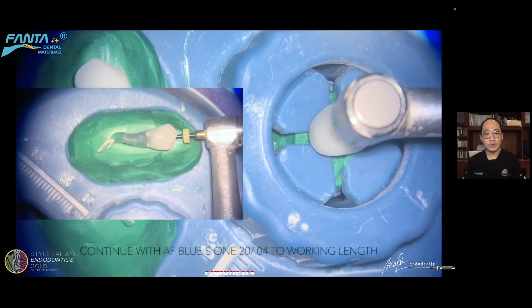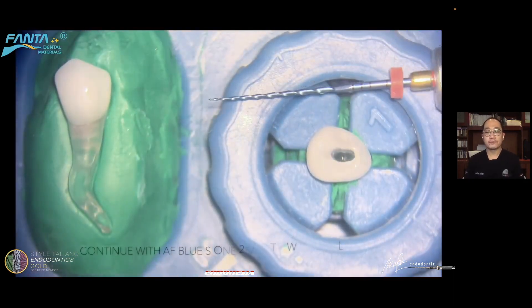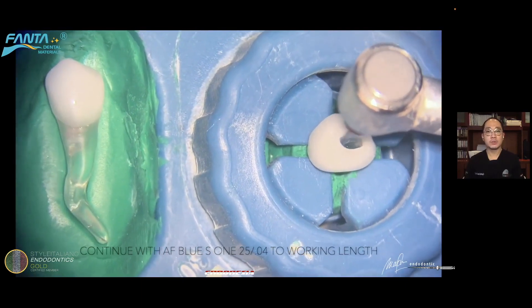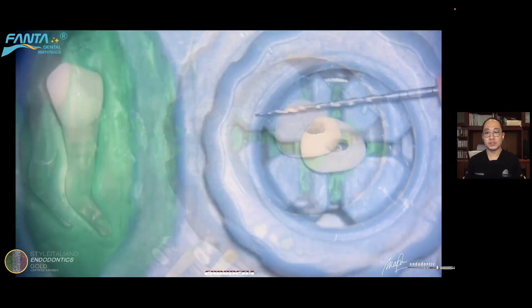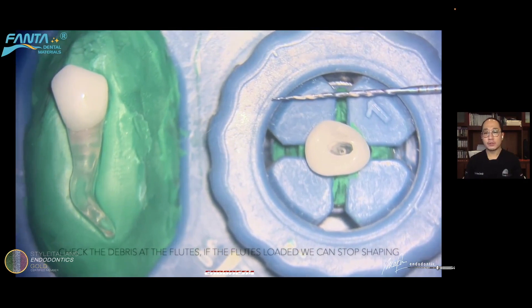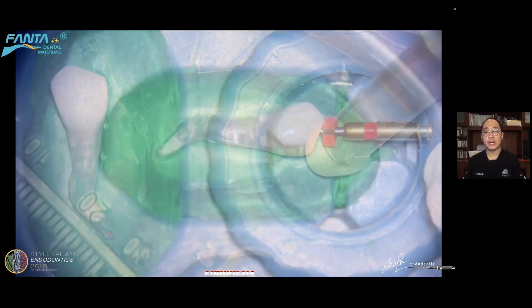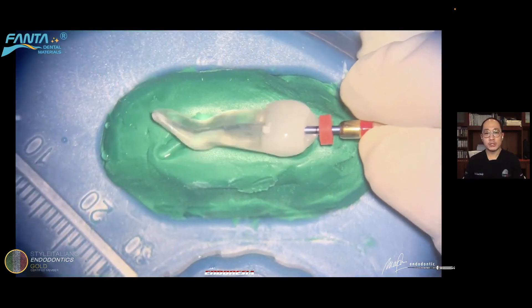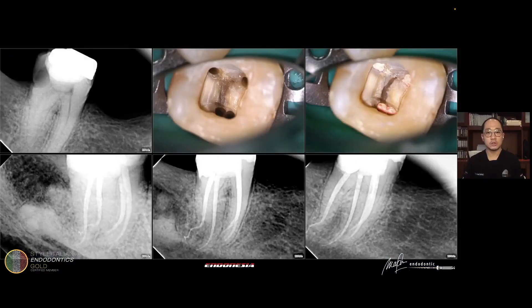After cleaning the flutes, continue again with the Fanta 20/04. After reaching working length, continue with the final shaping of 25/04 in this severe curvature or root canal dilaceration until working length. Check that there is enough debris at the apical flutes — if debris is loaded, continue shaping. If you see that debris is not loaded in the apical area, you might want to change to 25/06 to continue your shaping protocol. I stop at 25/04 to ensure I maintain a good shape of the dilacerated root canal.